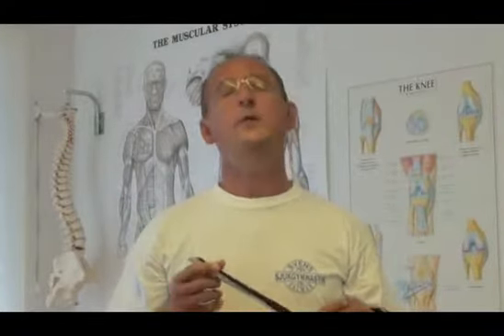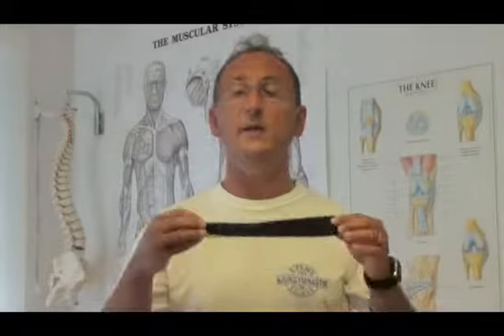because for us in Rehab Tape we think a little bit differently. If I have a muscle which is overused, I don't want to help the muscle to work more. I want the muscle to relax. I want to release it from the tension. And how can I do that? I can put the taping from the wrist up to the elbow, which means the tape is pulling down, and we know that it will relax the muscle when I do that.